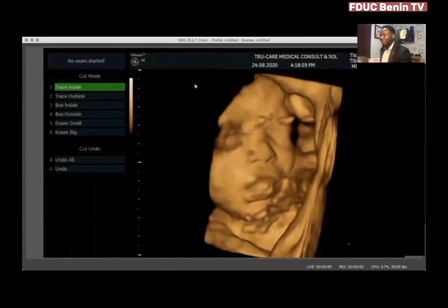I hope that someone is encouraged and not discouraged. Sometimes it can be a little technical, but at least we can see the nose. And the woman is here with me. I can see that the nose of the baby looks like that of the mother. So, Madam, are you happy seeing your baby? All right. So, sorry, this is what we can get for now.